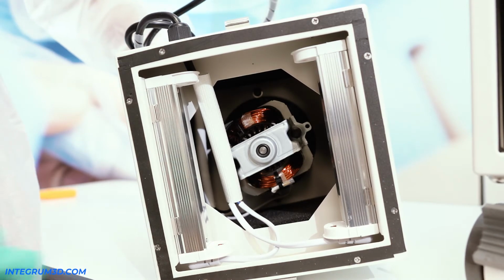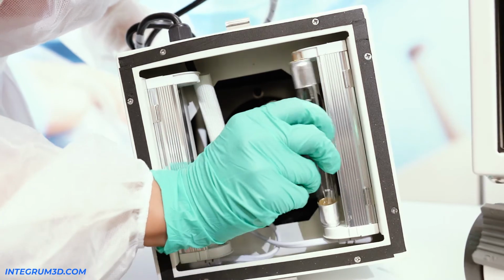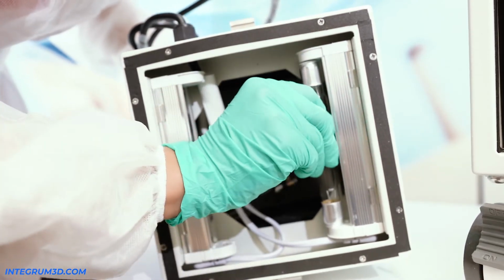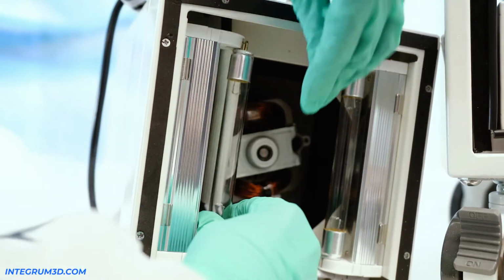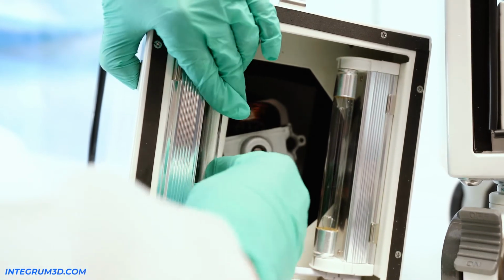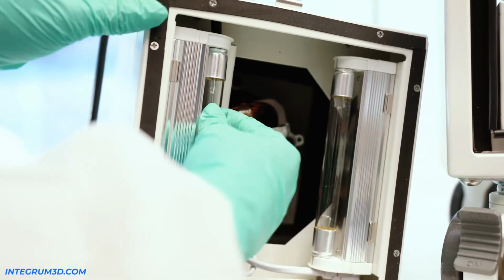To replace them, you want to put them in the slot down here, and then turn it to the right to make sure you lock it in place. Your other one, you can do the same thing, lock it in place, and then towards you to lock it in place. They don't move and they're locked.